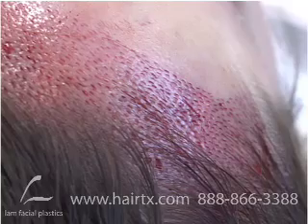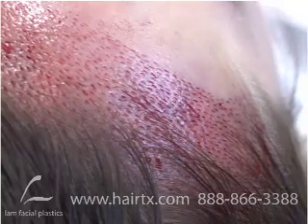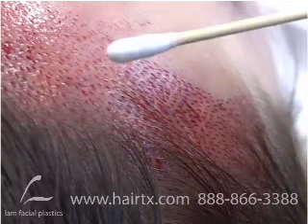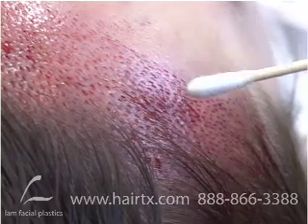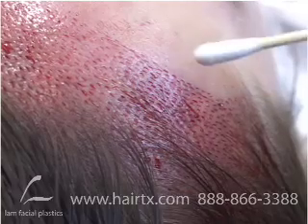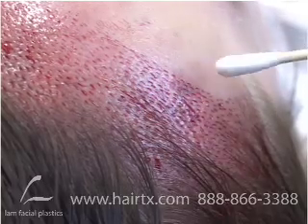Okay, we are now at the right side of the hairline. What you're seeing right now is that the angles start curving down and forward to match the temporal hair. So there's a little bit of an anterior push on this, but not so much that it actually has a hairline going anteriorly. You don't want that.